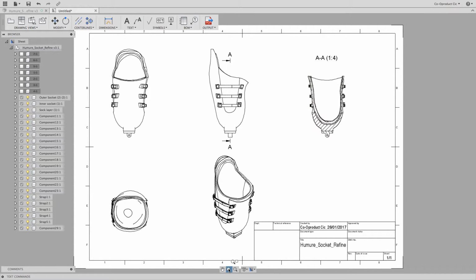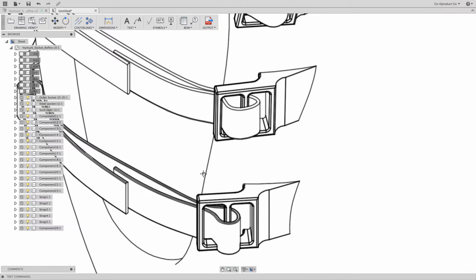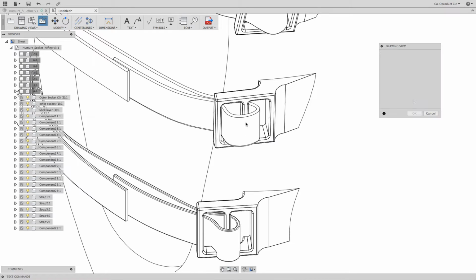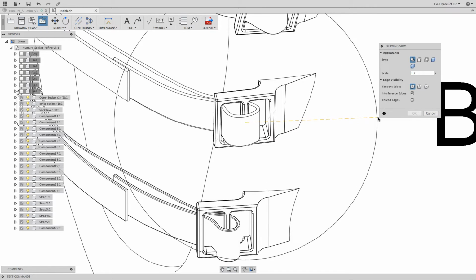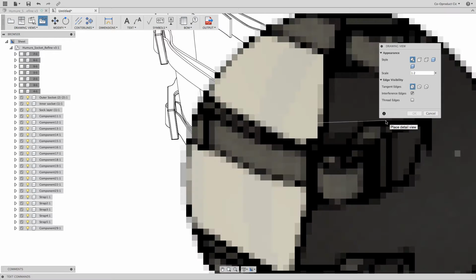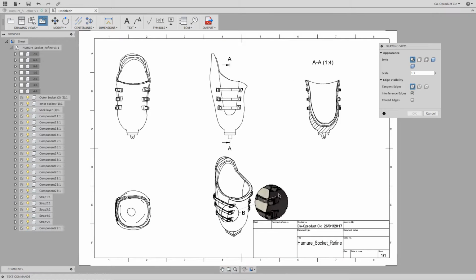I'd also like to place a detail view, so to do that, I'm going to zoom window into the buckles. Then in the toolbar, I click Drawing Views, Detail View. So I have to select a parent view, which is this one, so I select this view. Then I have to select the center point for the detail view and drag out. So I'm dragging out from the center of the buckle to about here. For the detail view, I want to feature the buckles and focus on their manufacture via 3D printing. I'll click Fit to Window in order to place the detail view.